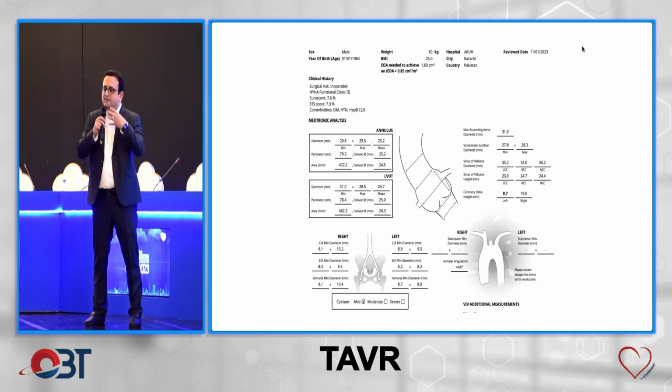So for core valve and the self-expanding valve, जो Boston का भी है, इसके लिए भी we go by perimeter, or for the balloon expandable valve we go by area, because balloon expandable में अगर आप you oversize it too much, there is a high risk of perforation versus a self-expanding valve, जिसके अंदर there is a low risk.